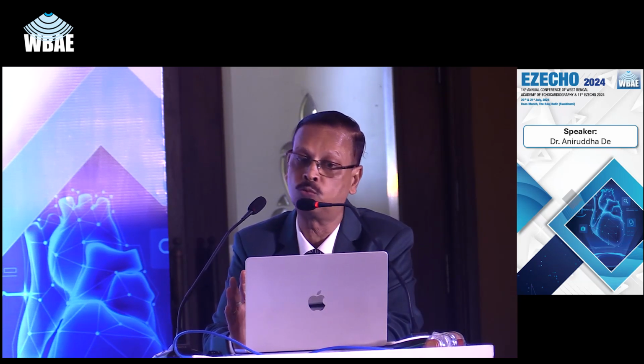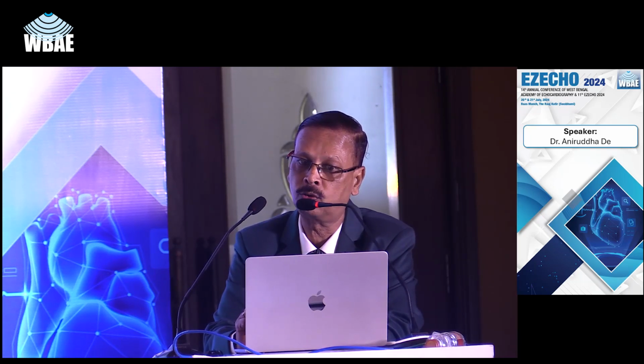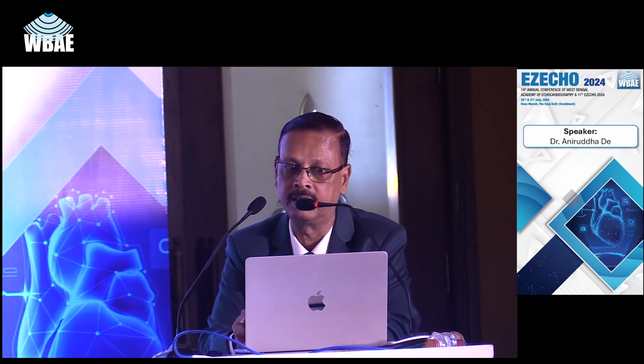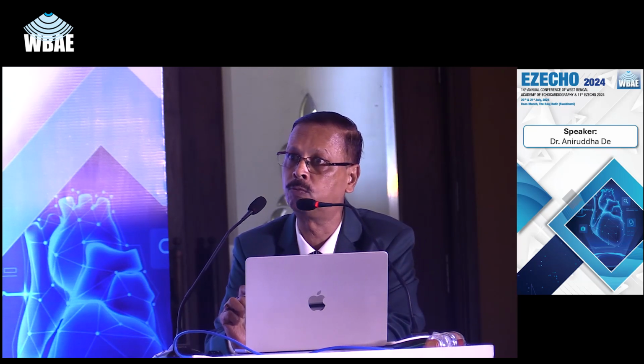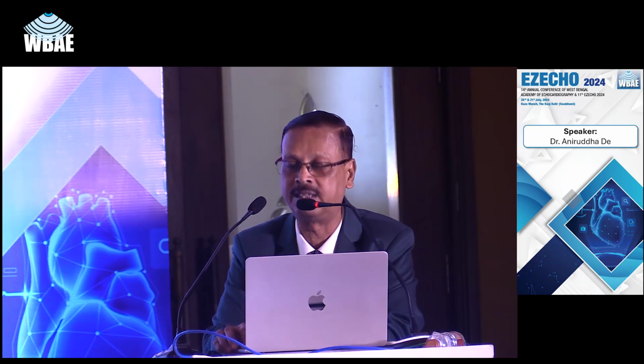So my final slide is that all measurements have good accuracy. Thus, choosing which one to use depends on other characteristics, such as tool availability in the software, which may not be available in the equipment used. Reproducibility issues should also be considered, such as the variability using pulmonary venous flow pulsed Doppler and the flow propagation velocity. Therefore, I do recommend IVRT and the septal E by E prime ratio continue to be strongly recommended in case of atrial fibrillation. Why? First, for being simple and practical, and second, for being commonly used in basic protocols.